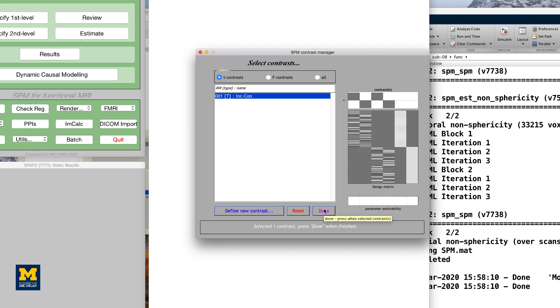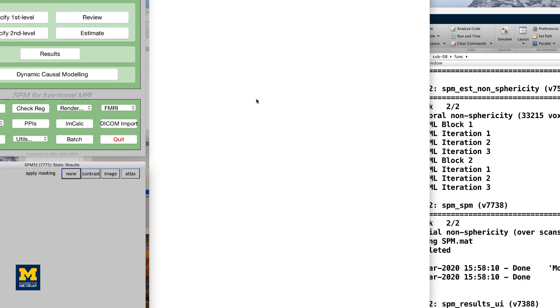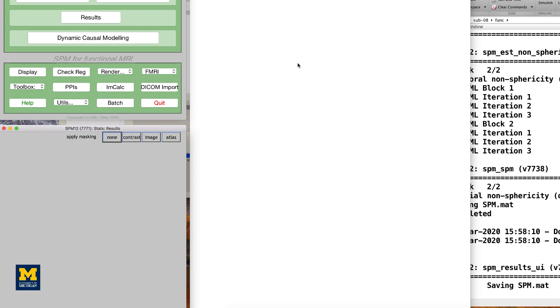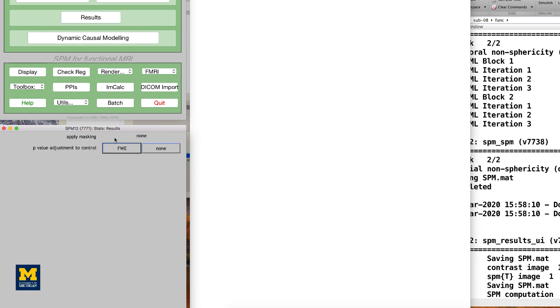Double-click on the contrast INC-CON to open the Results window. You will first need to set a few options, which are explained in more detail in the link to the eBook below.